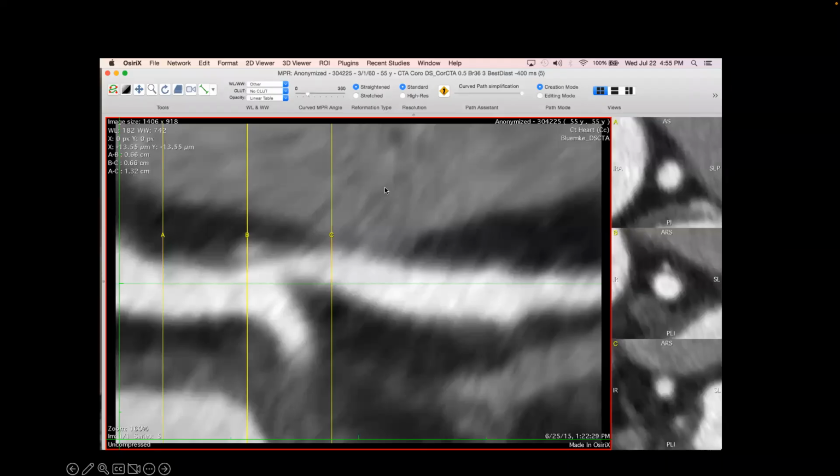Okay. So I think we looked at this a little bit, not on Monday, but last Wednesday, where we were looking at coronary CTA, or coronary cardiac computed tomography, where the diameter of a vessel such as this, of a coronary artery, which is about, say, 4 millimeters up towards the aorta, the proximal part, gets narrowed down by some kind of lesion.